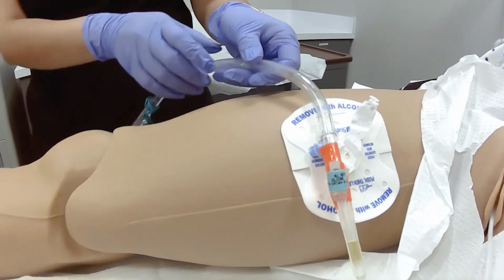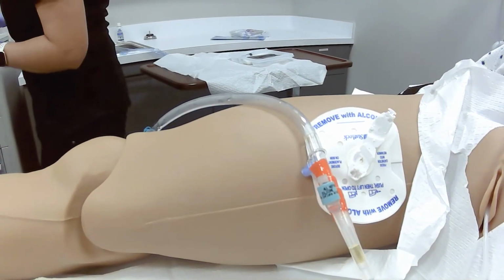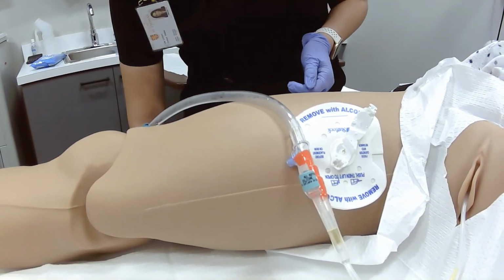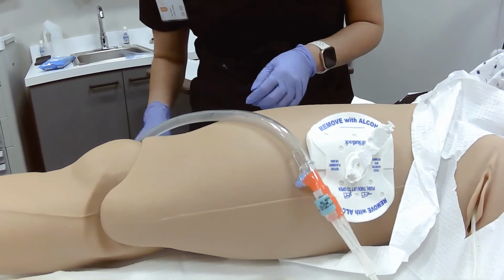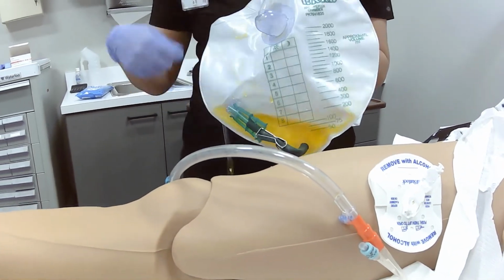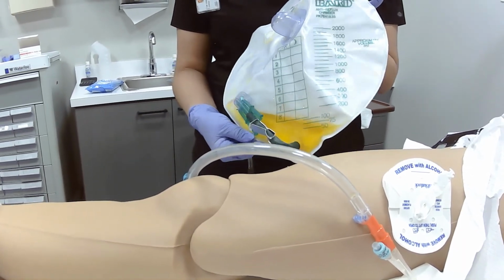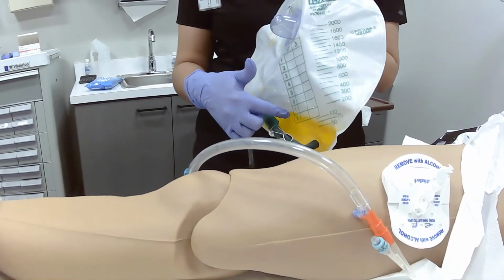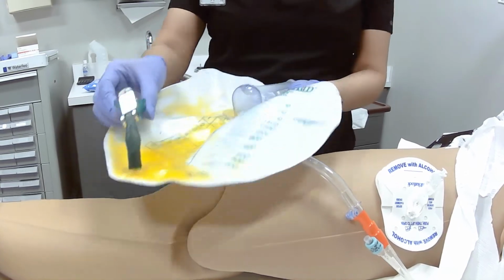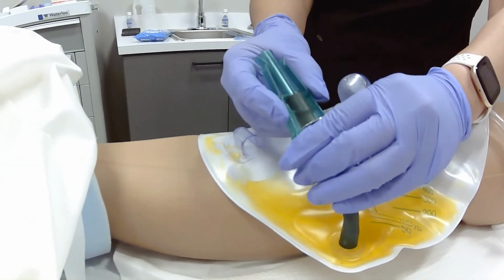The other thing is, the first urine that you get when you insert the catheter is sterile. So you can collect it from the bag itself, because the bag will be sterile at the very beginning. Once it's been sitting there for a little while, it is no longer sterile, so you cannot use this urine, okay? So to open this piece of the catheter bag, I'm just going to show you carefully so that I don't spill this urine.